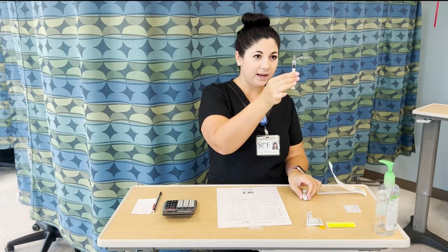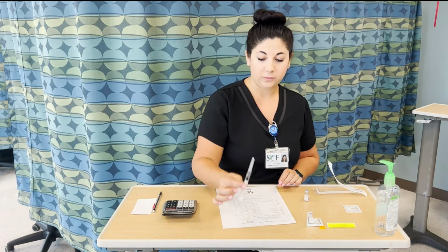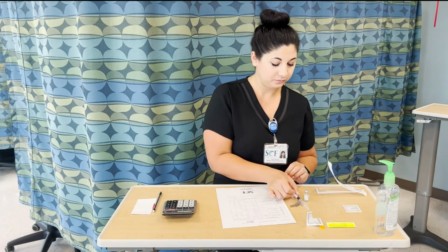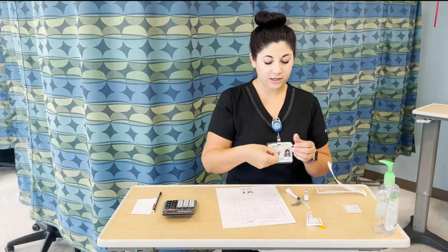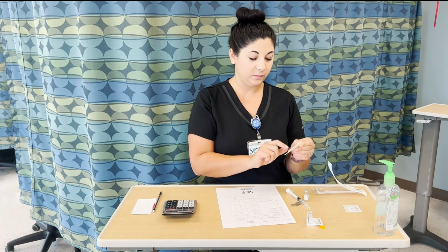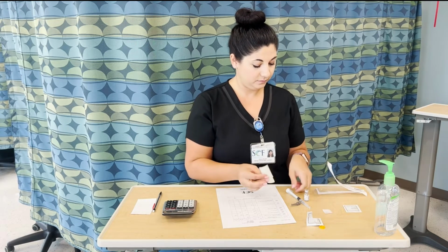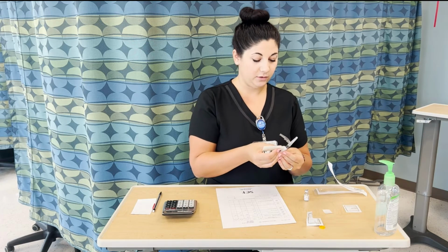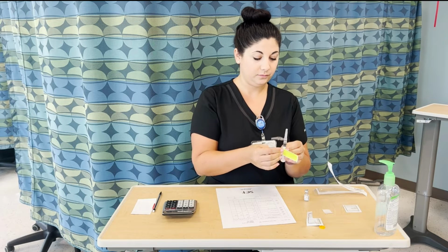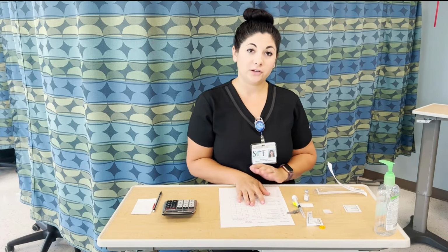Once I have made sure that I have the correct dose and there are no air bubbles in there, I will recap using the one-handed scoop and make sure that it's on there tight. Then I will label my medication with the patient's initials, the drug name, the dose in milligrams, and the date and time that I have prepared it. Putting that out of your way so you can still see your medication. We'll dispose of my trash and go to my patient's room.